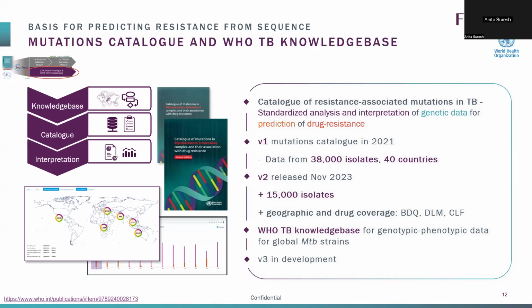So the earlier you get it into this database, the better. So there is some capture. Even if we say, hey, we've seen 5 occurrences of this, people are flagging it in some cases. We want to have enough statistically significant data to push it up to saying definitely associated with resistance, but at least you'll start seeing it here as potentially associated, or a low confidence association. And over time, that could get bumped up to the next level.